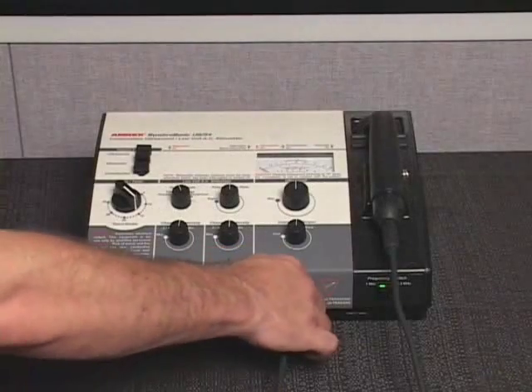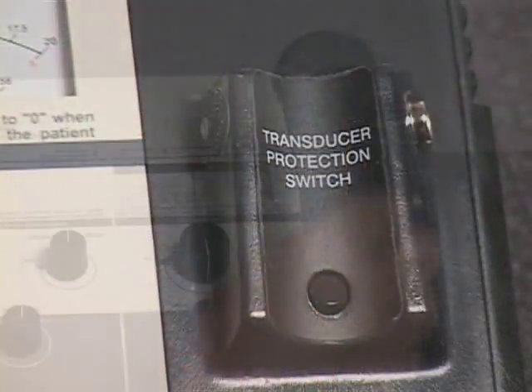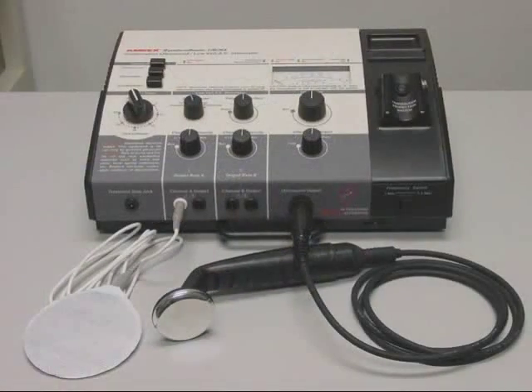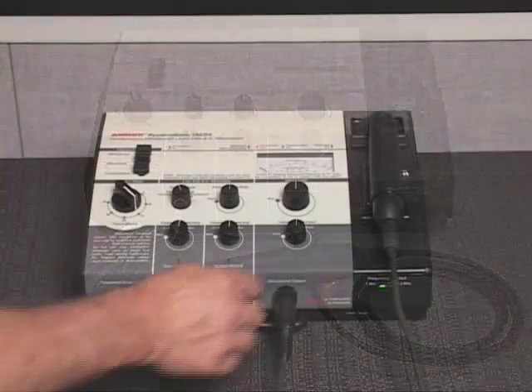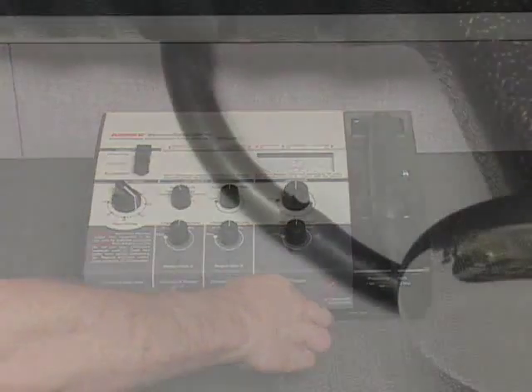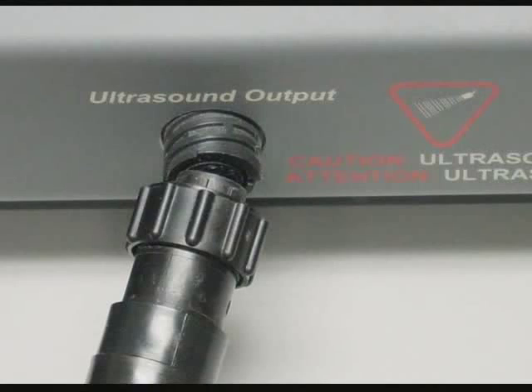The US54 is equipped with a cable fault alarm system, transducer protection switch, interrupted output, and has combination therapy capability. The cable fault alarm system will alert the user to transducer cable damage or improper cable connection by activating an audible and visible alarm.